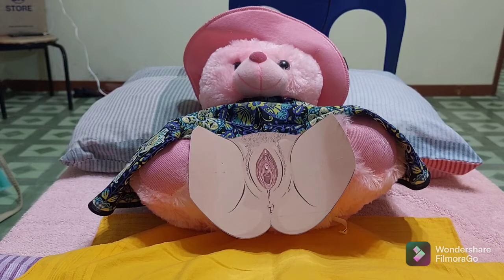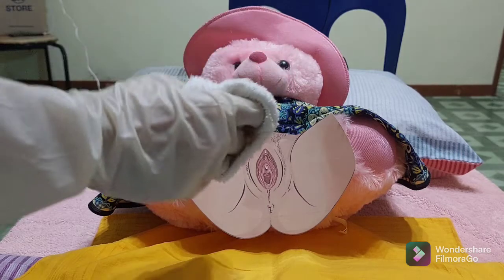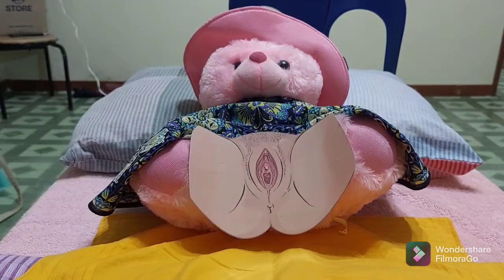I'm going to separate the labia and then wipe from the clitoris and down. Then I'm going to put the used washcloth into the hamper and use a new one.